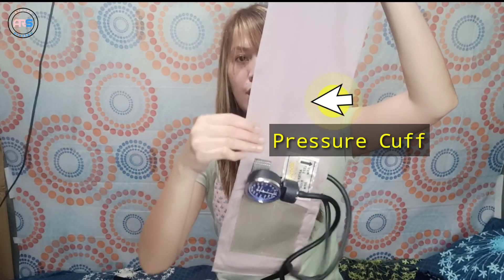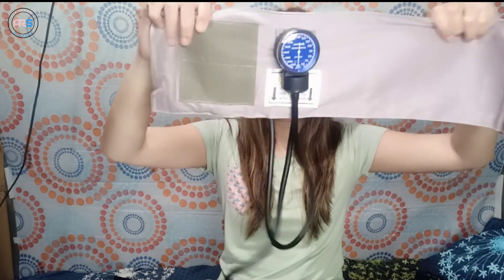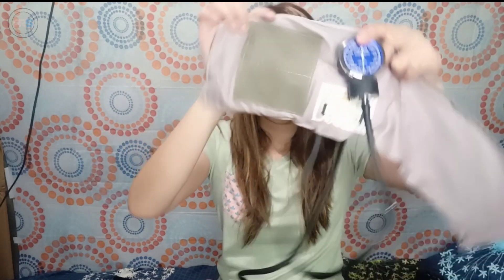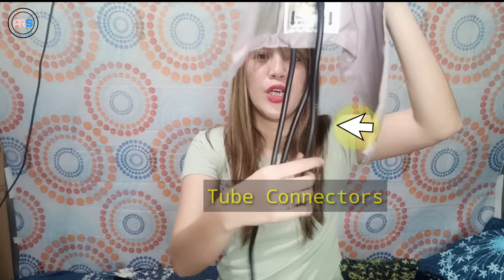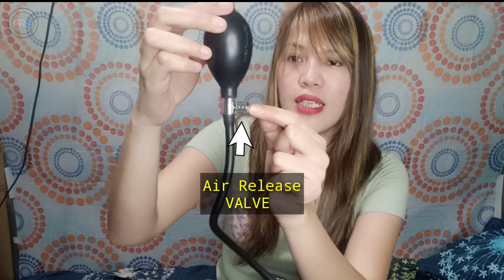So, na-assembled na natin yung sphygmomanometer. These are the parts: first, we have the pressure cuff. And this is the aneroid manometer gauge. And this one is the tube connectors. And this one is the air release valve. And this one is the inflation valve. Ayan po yung parts ng pang-BP natin.